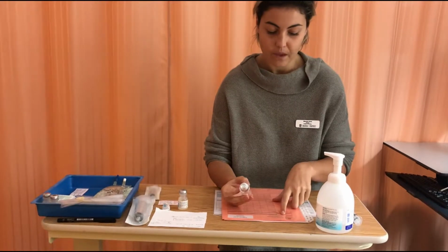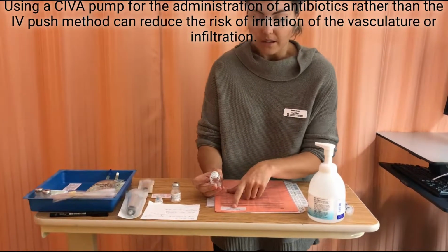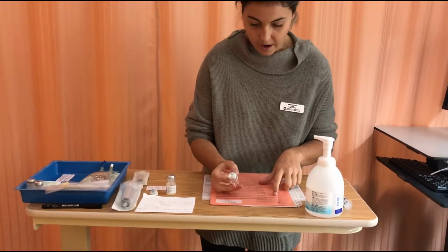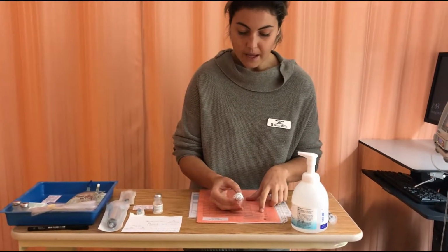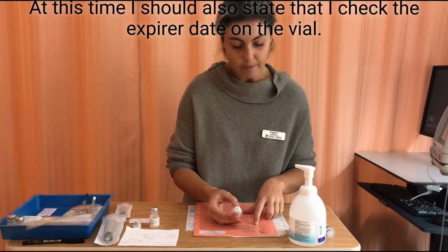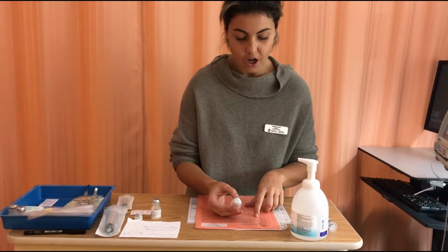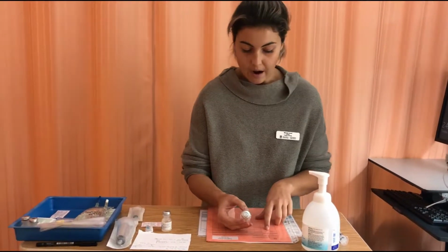So I'm just making sure that I have the right patient. So this is for Emma Wrightson, and then that I have the right drug, Penicillin G for injection, so IV, 3 million units. There's 5 million units in here, so that's good. And for right now.